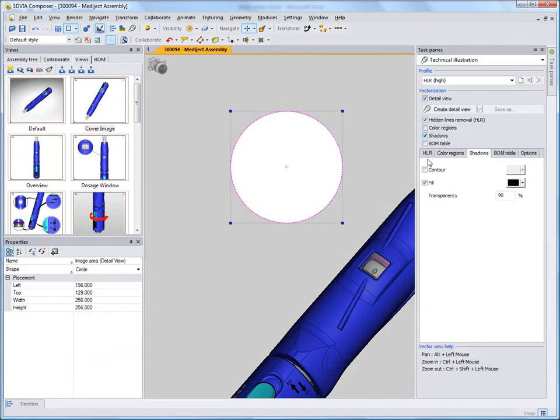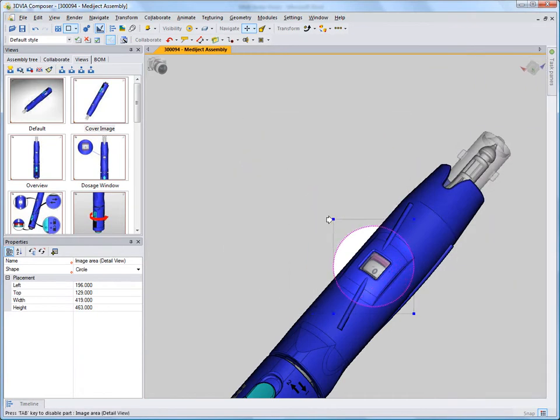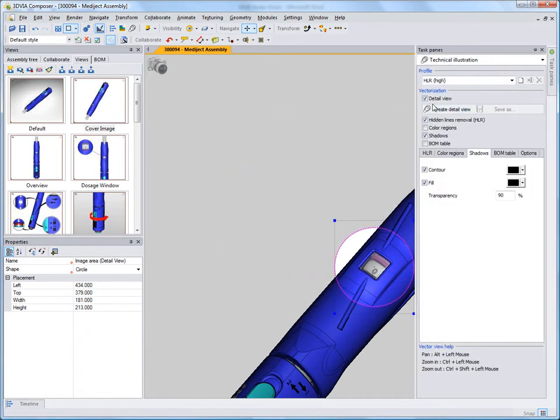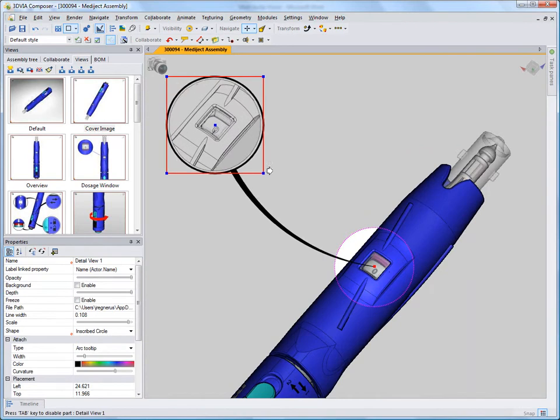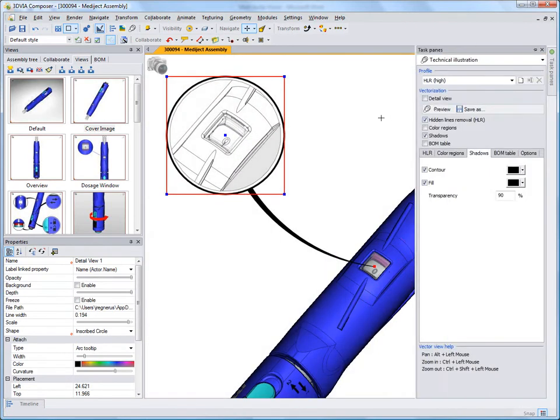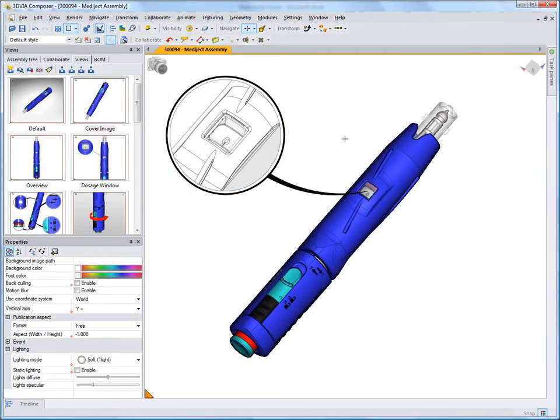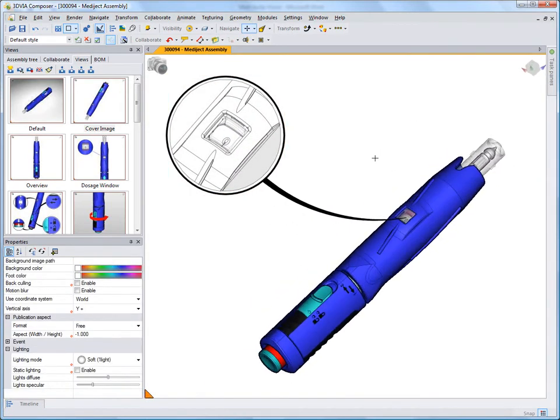With 3D via Composer, documentation can start early in the design. Using the native engineering and design data, content for final documentation can be created early on, with the knowledge that any changes can be easily incorporated.